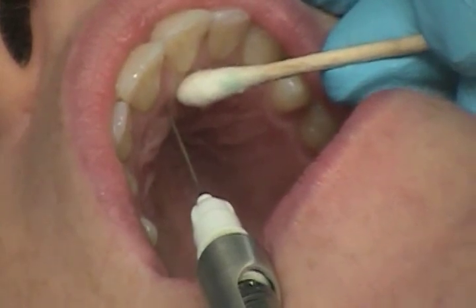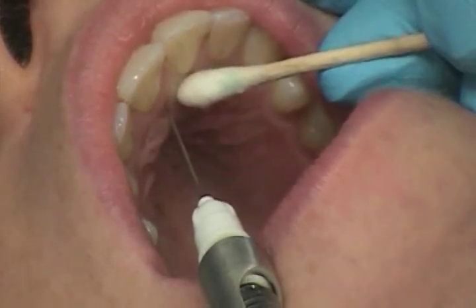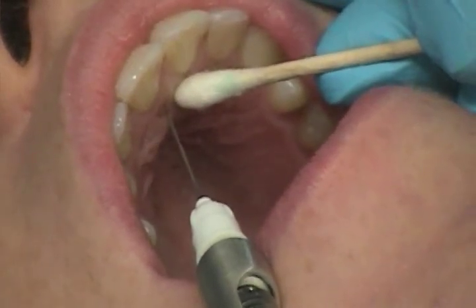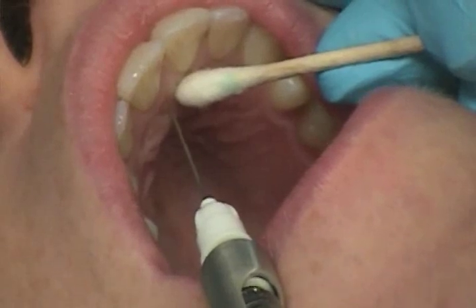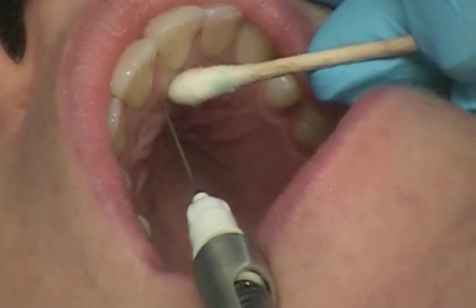The bevel orientation is against the palatal soft tissues. Pressure anesthesia: yes, before and during the injection. The depth of insertion is about 5 millimeters. Osseous contact: yes.